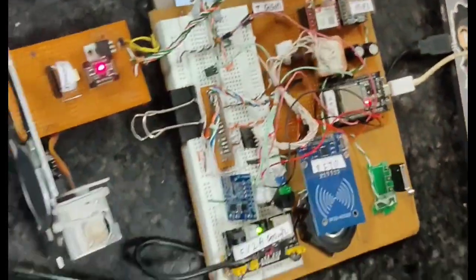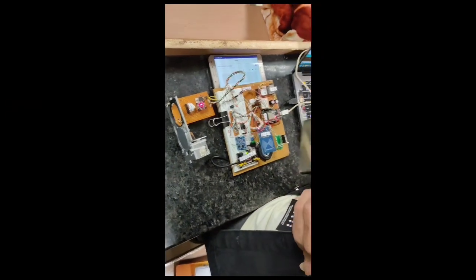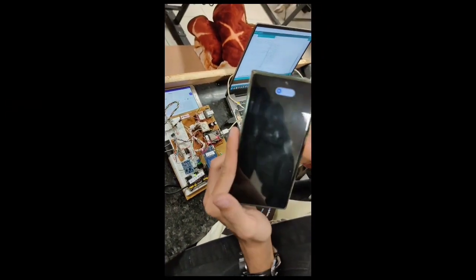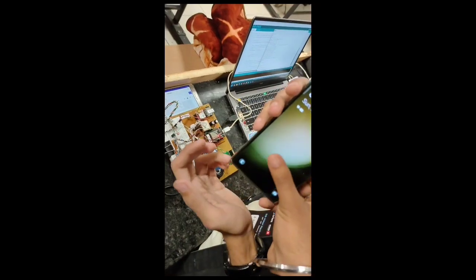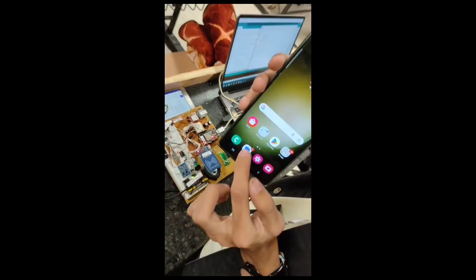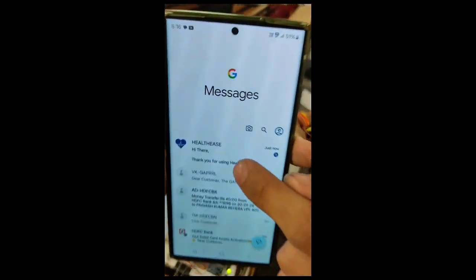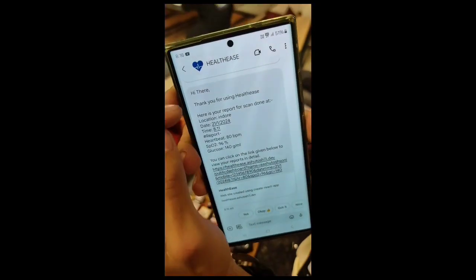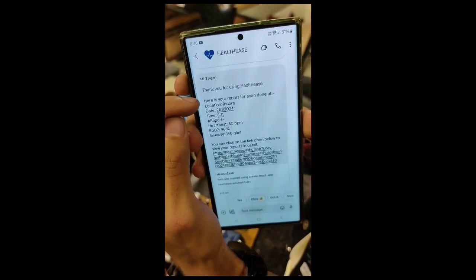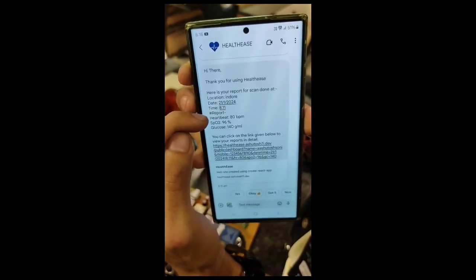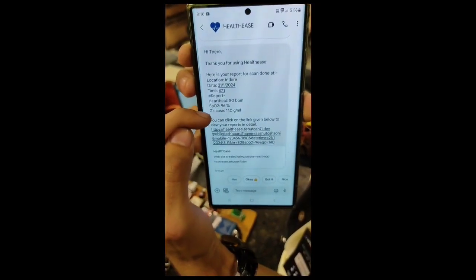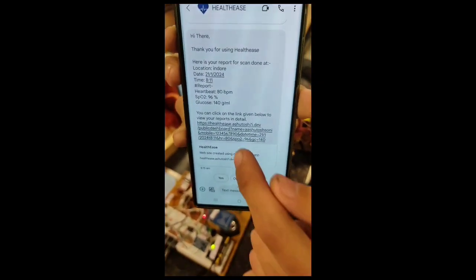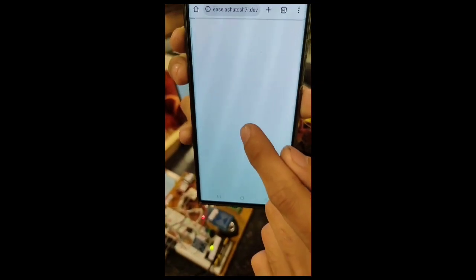I'll show you the message in this video itself. This is the mobile phone we're using. Here, as you can see, there's a message from Healthies. It says 'Hi there, thank you for using Healthies,' with data, location, time, heart rate, and SPO2. There's also another thing - you can use this link. It's dynamically generated for each user. This link contains his data.